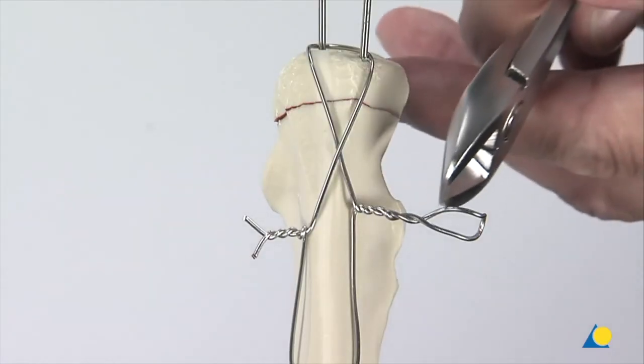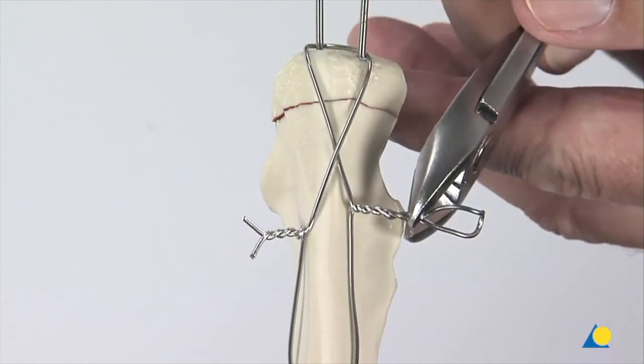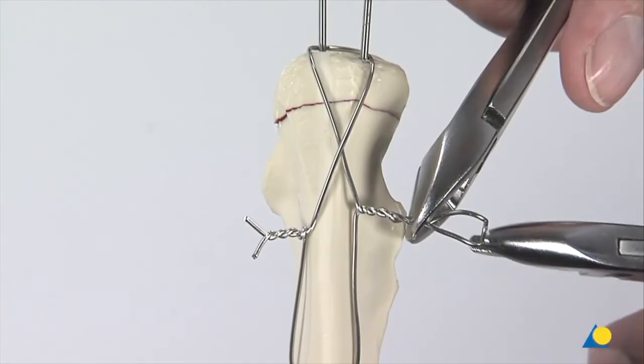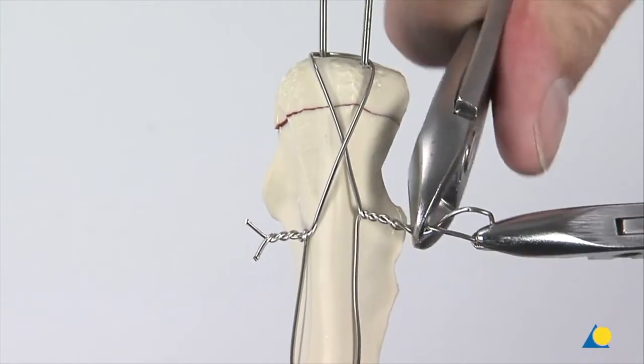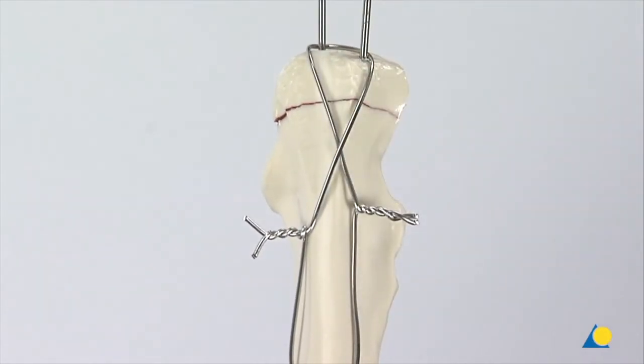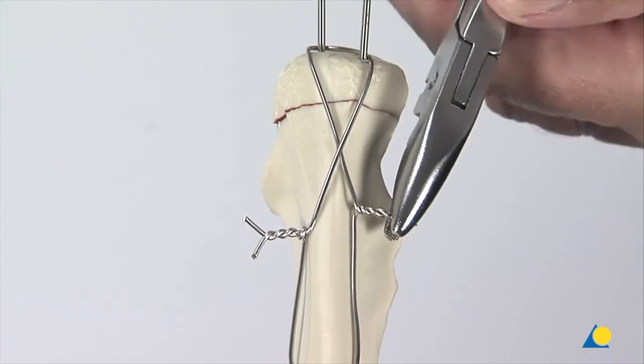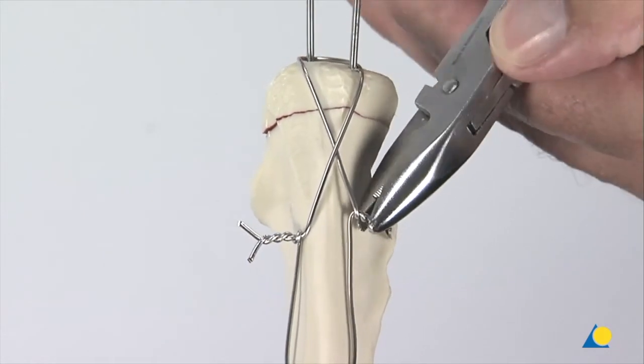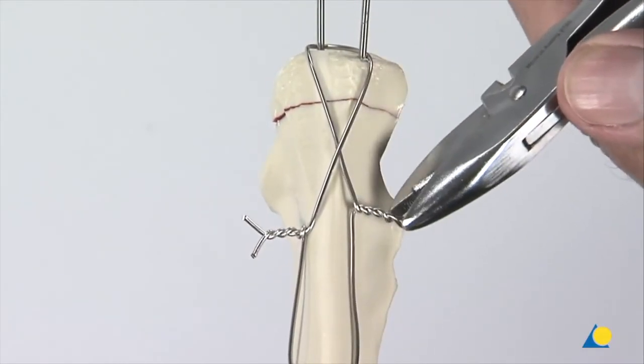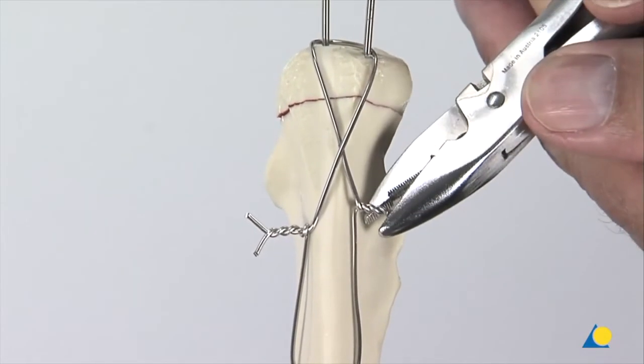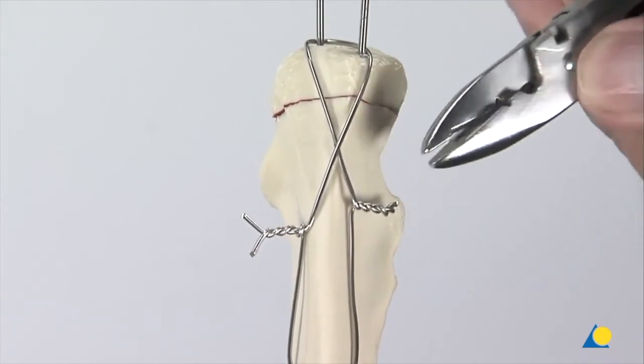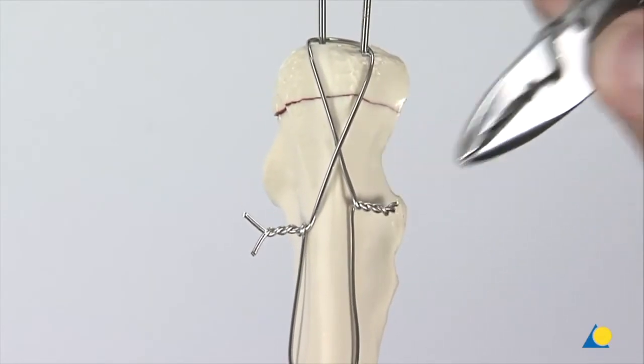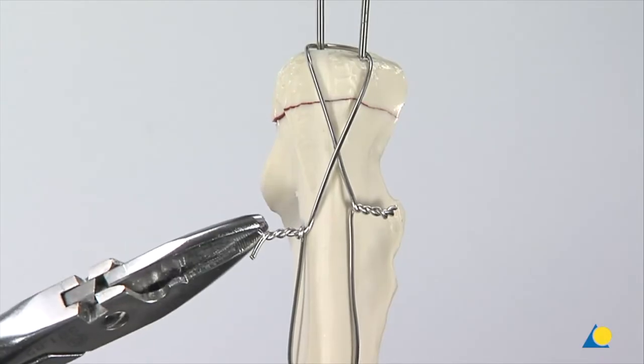The excess wire is trimmed with the wire cutter. Using the wire bending pliers, the wire is bent so that it lies close to the bone. This step is repeated on the other side.